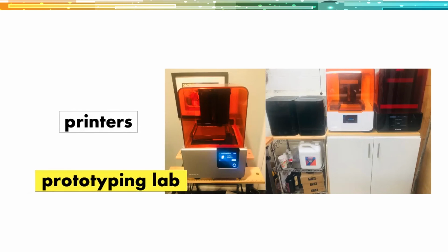You can see those 2 black units on the left. Those are the isopropyl alcohol washing. It's basically all automated. And the one all the way to the left is the curing oven. All biocompatible resins need to be heat cured to achieve their biocompatibility and their full strength.